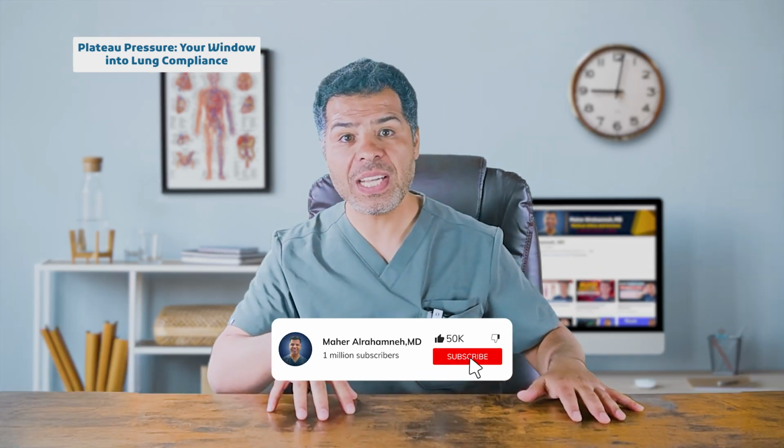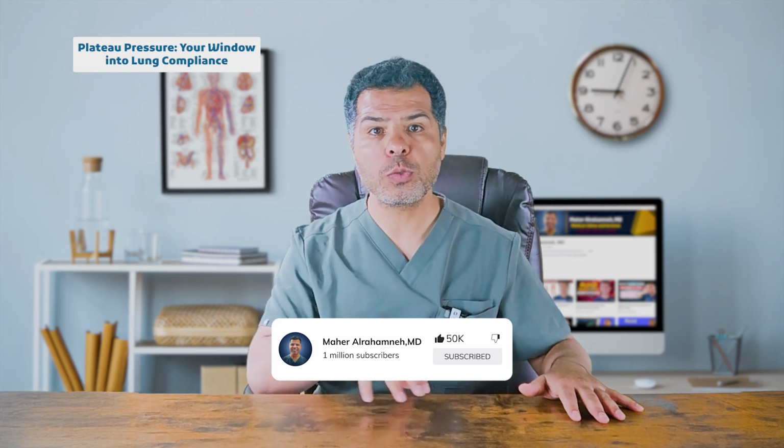We mentioned earlier that the only pressure the ventilator provides during expiration is the PEEP, correct? This means the expiratory flow will continue until the alveolar pressure is equal to the PEEP, when the flow then ceases. So normally, the pressure measured at the end of expiration, when the flow is 0, must equal the PEEP value. To confirm that, we perform what we call the expiratory pause or hold maneuver. This maneuver allows us to check for any gas trapping and auto PEEP.